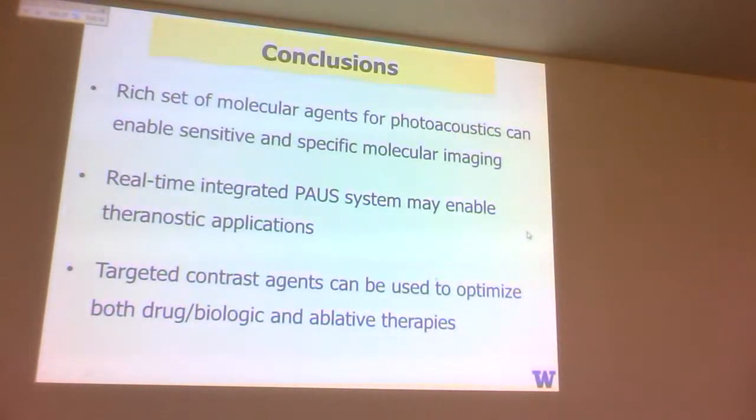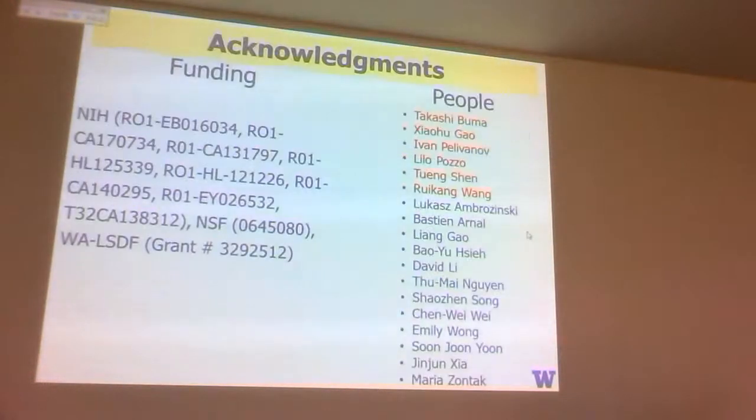So like I said before, with the drugs to go in there, here's another one which we've talked to people about but not done, which is that in the agents themselves, we can load up some drugs. So they can be taken in, we can monitor them just like you're doing, and then we go into a mild ablative mode and deliver the drug whenever you want. So have an image-guided, not only drug delivery in terms of macroscopically siting it in the same place, but also actually activating the agent effectively in the region.